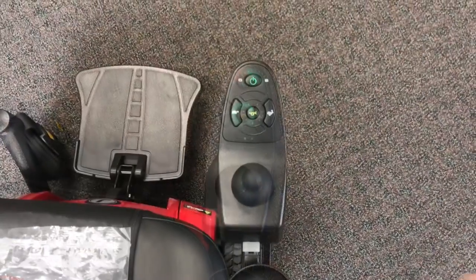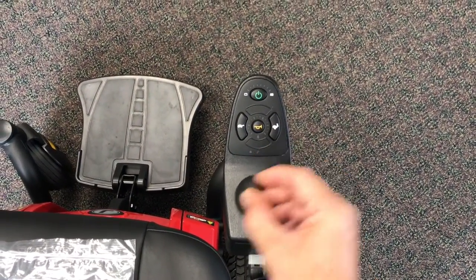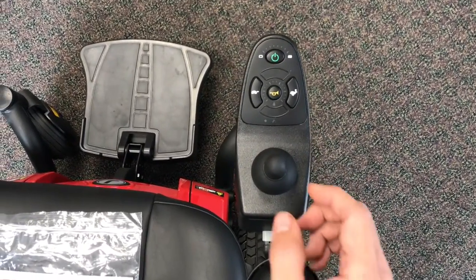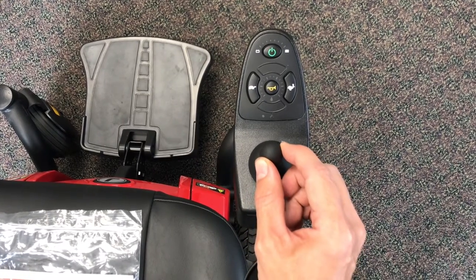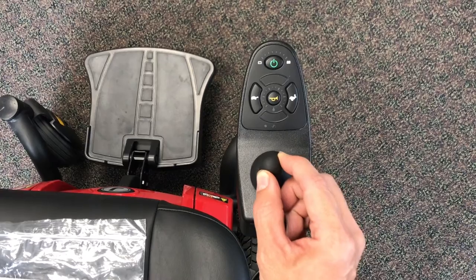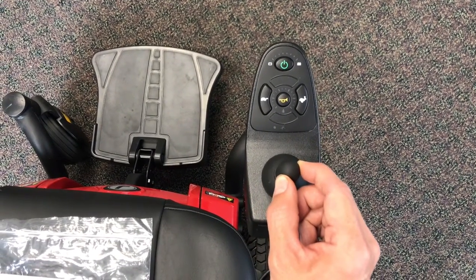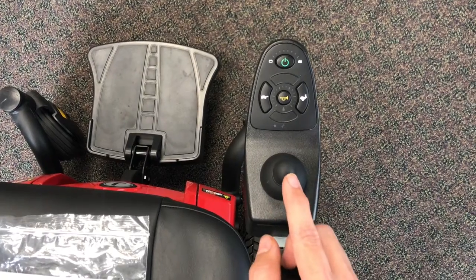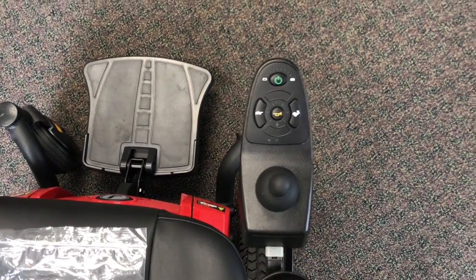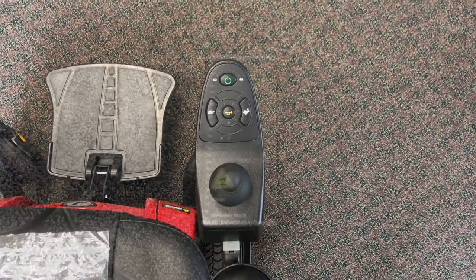Here's a little tip for driving the chair. Pressing the joystick all the way to the maximum it will go — all the way to the end — is going to give you a very herky-jerky ride. It's better to make very small movements with your fingertips. Big movements where you push it all the way to the end and then it stops is going to make the chair very hard to control.